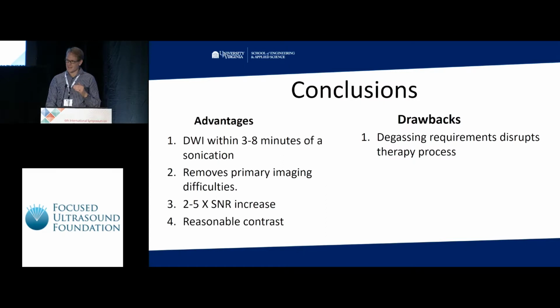The main drawback, and what we need to improve on, is that if you drain the water bath and then you want to fill the water bath up, you've reintroduced gas to the water bath and you have to wait to degas it. So I feel that there's still some refinement that needs to be made on this technique.